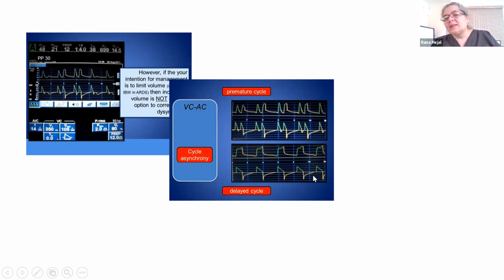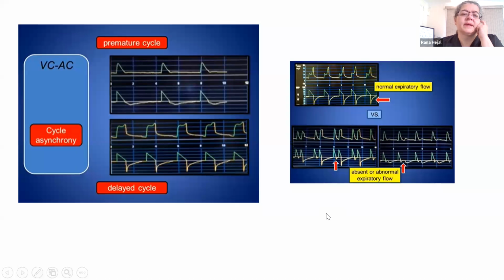So when that happens, the patient tends to not like it, and you'll end up with a little bit of a beaking at the end of the pressure waveform because they keep on exhaling it out. So what you need to do in those settings is to give them less time to inhale. After all, inspiratory time, when it is optimal, facilitates adequate oxygenation. You don't want it too short and you don't want it too long. You just want it just right. And in order to optimize it, you have to look at what's happening with the pressure curve.